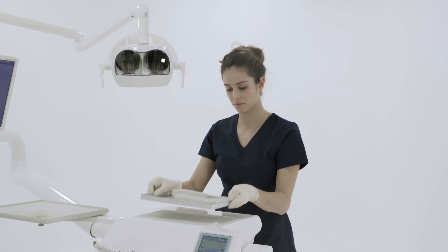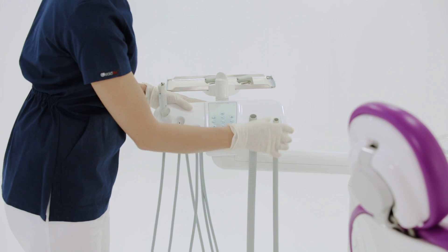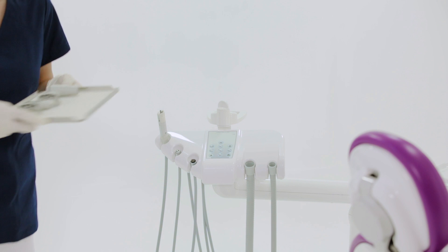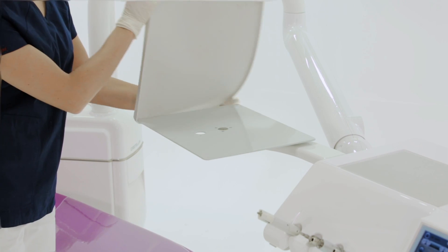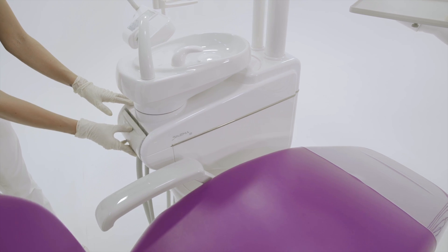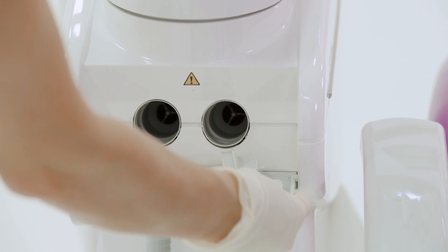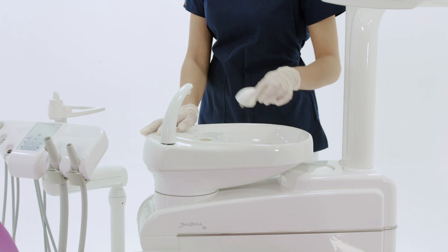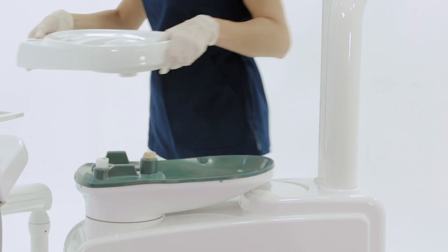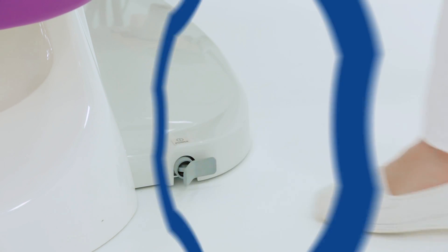Finally, to complete the end of day task checklist, the assistant removes all removable and autoclavable parts of the dental unit to take them to the sterilization area. The assistant can then turn off the dental unit.